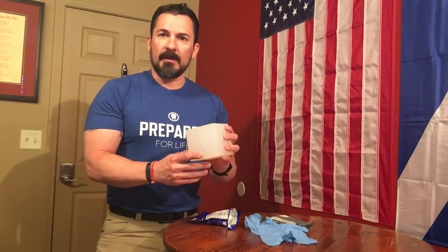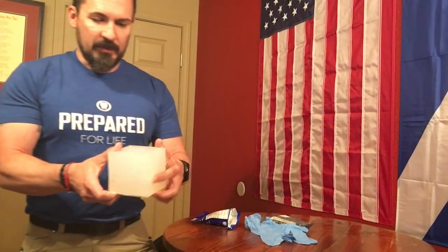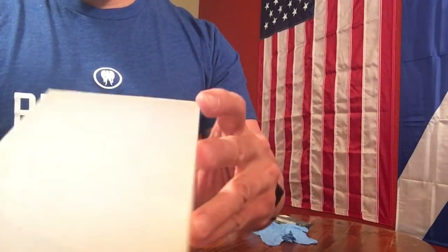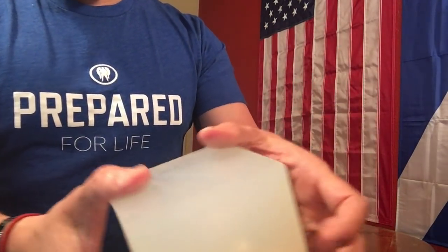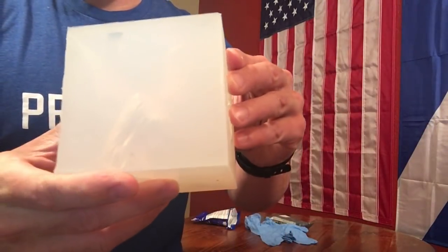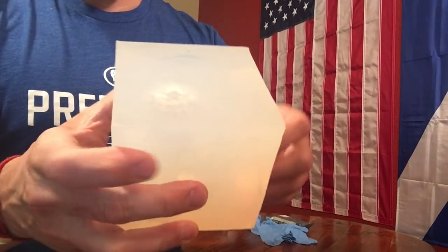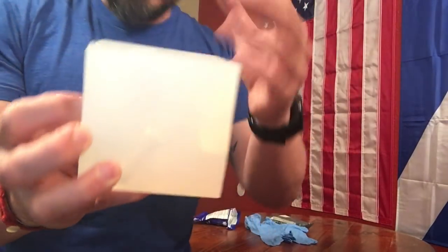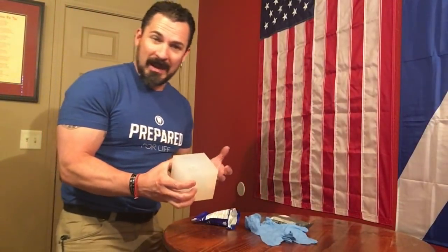This is a continuing portion of our online training, and today we're going to talk about wound packing. What I've got with me right now is the Focus Research Wound Cube. It has 4 different wounds in here, and one we're going to be packing into. You can see different wounds on here that one can pack and utilize different types of pressure dressings and hemostatics, you can try them out. But you'll notice there are different wound characteristics, different wounding patterns to these things.